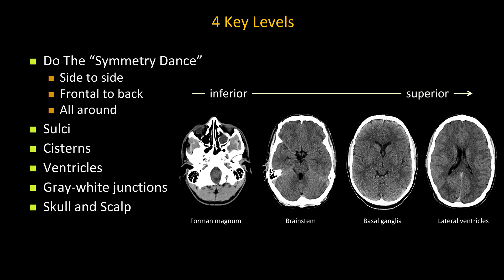The four levels to focus on, from inferior to superior, are the foramen magnum, brainstem, basal ganglia, and lateral ventricle. When you inspect each axial view, make sure to compare side to side — symmetry is important; what's on the left should look like what's on the right. Look all around and inspect all the sulci to make sure they are patent and not being compressed. Look at all the CSF spaces such as cisterns and ventricles, and inspect gray-white matter differentiation to make sure it is preserved.